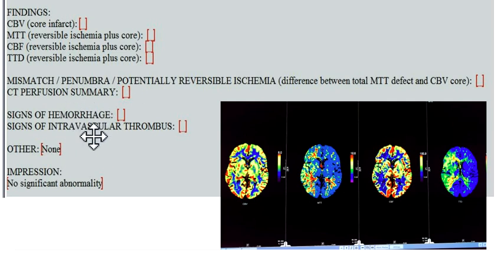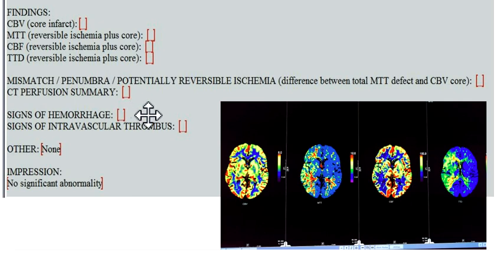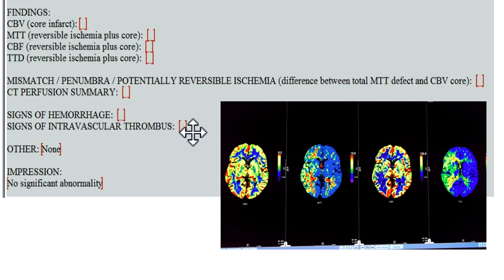Two additional items are important enough to include in the template even though they come from other sequences. Signs of hemorrhage: look at the non-contrast head CT and note none on the recent non-contrast head CT. Signs of intravascular thrombus: look at the CTA — in this case, right M1 occlusion from thromboembolism.